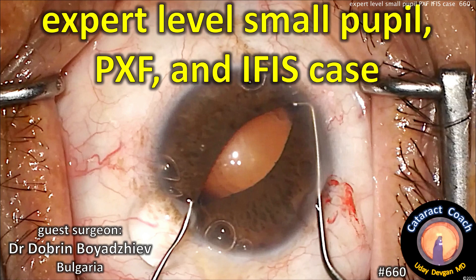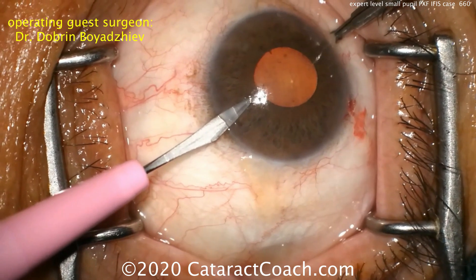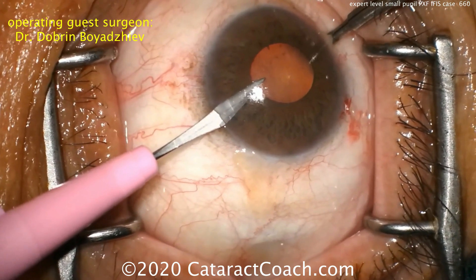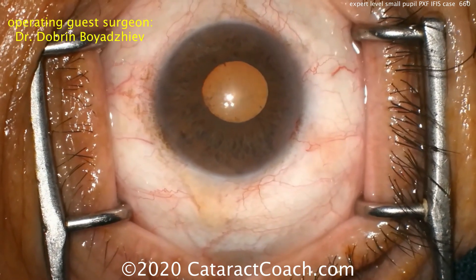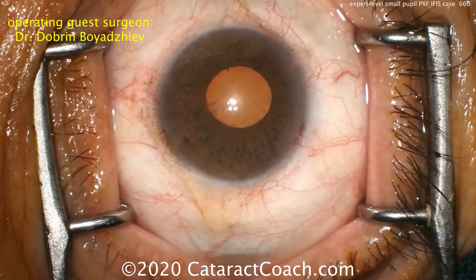CataractCoach.com expert level small pupil case with pseudo exfoliation and IFIS. Guest surgeon Dr. Dobren Boyadziev from Bulgaria. Look how shallow the anterior chamber is — a very shallow anterior chamber. The pupil here looks to be about three, maybe four millimeters in diameter.